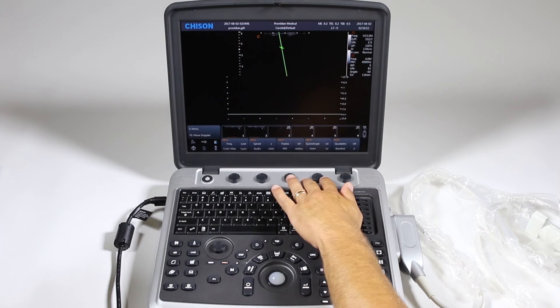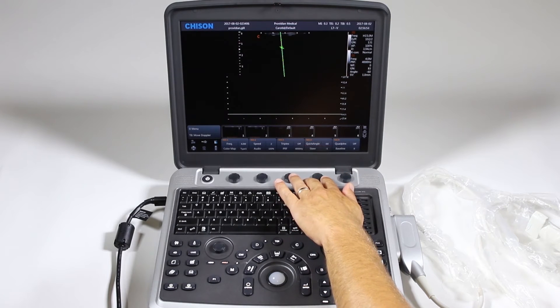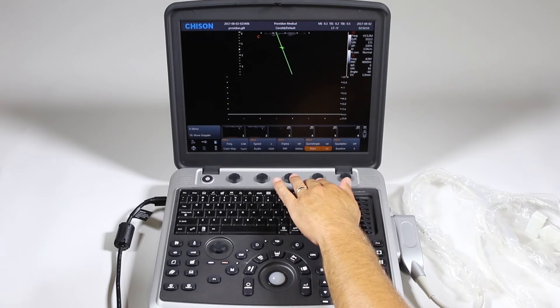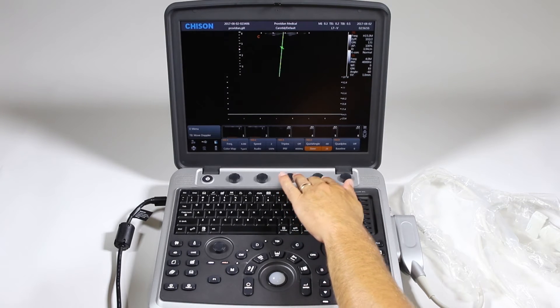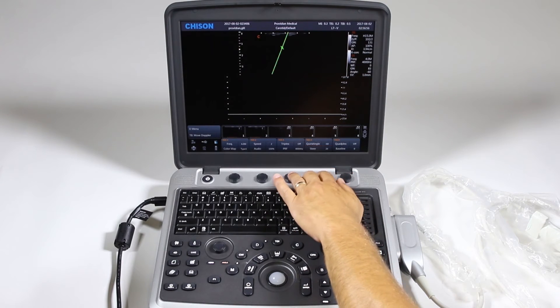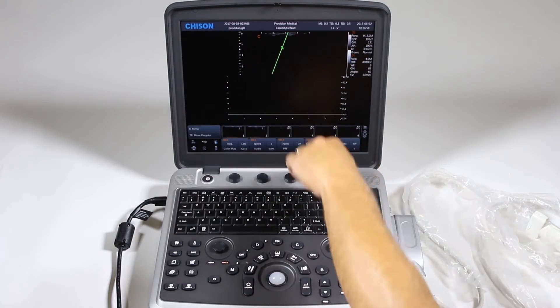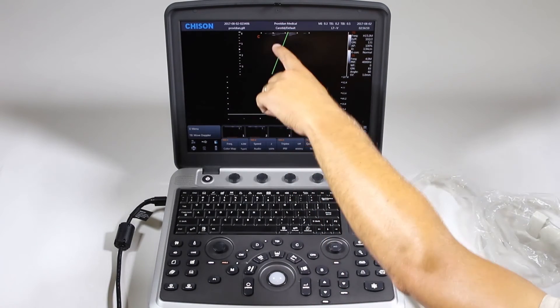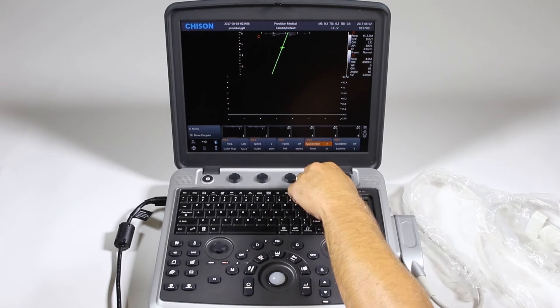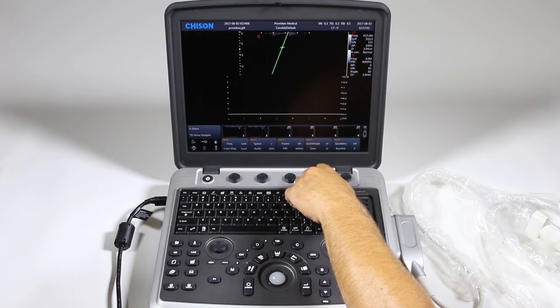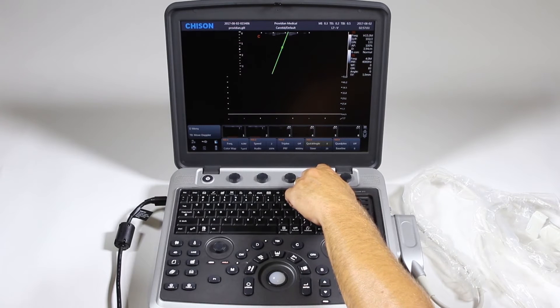We'll just go ahead and click update. Here we can steer the angle. You can also do quick angle that'll take you directly to 60 degrees and we'll flip right through. Go 60, 0, negative 60.